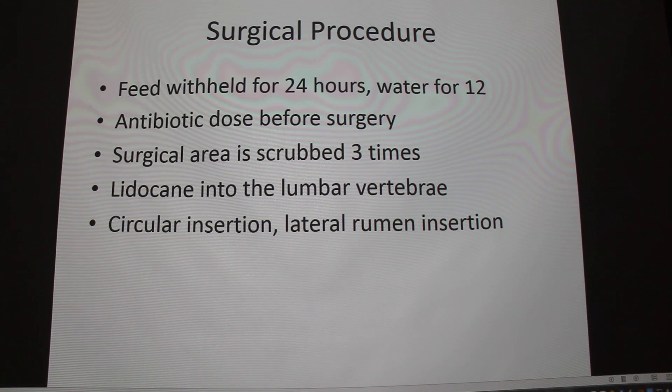So you administer 2% lidocaine — 15 cc's to three of the vertebrae in the lumbar: vertebrae 1, 2, and 4. I don't know why they skip over 3.